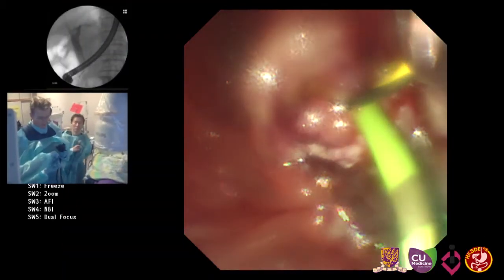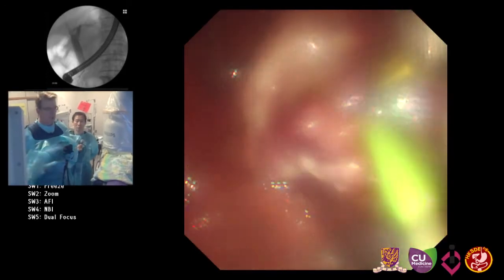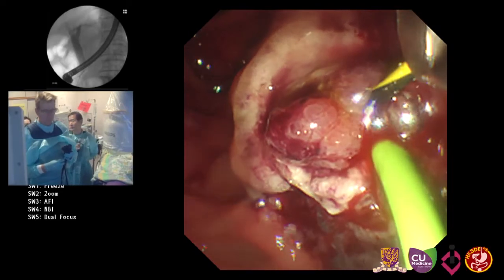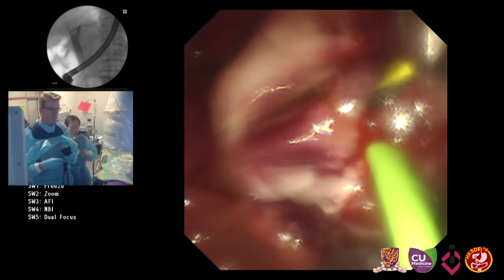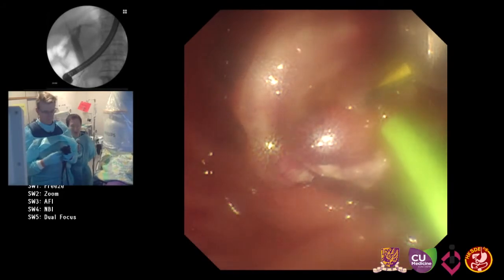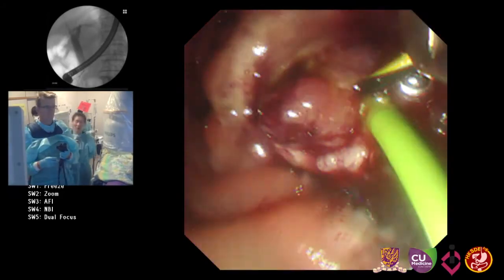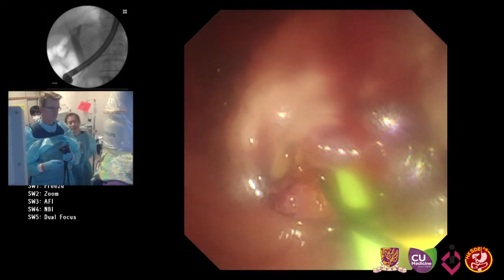And this is a great innovation, being able to put stents that are reliably removable, as demonstrated in the large multi-center trial. This is a real innovation now. Yes. Because a fully covered one, we can remove up to 6 months after. But after 6 months, sometimes the membrane can disrupt and the metallic mesh can be embedded in the tissue. So within 6 months, I think it's always possible to remove it.